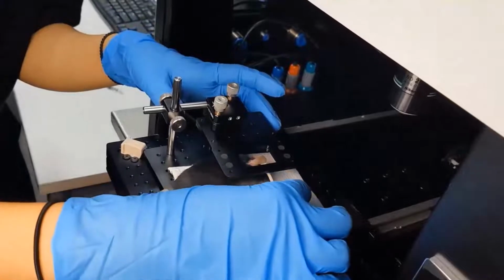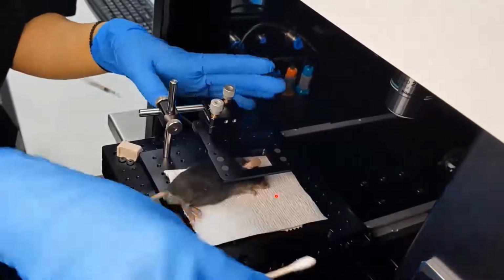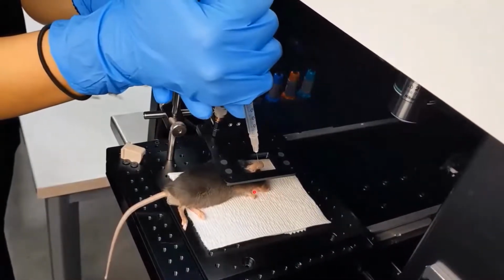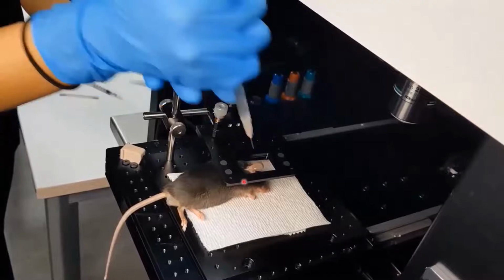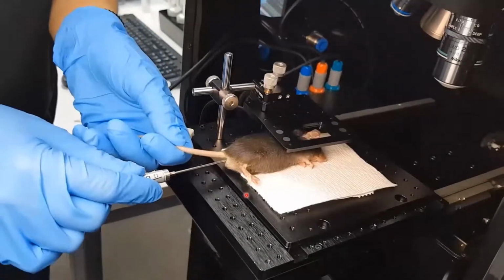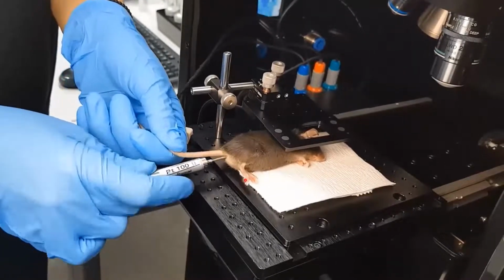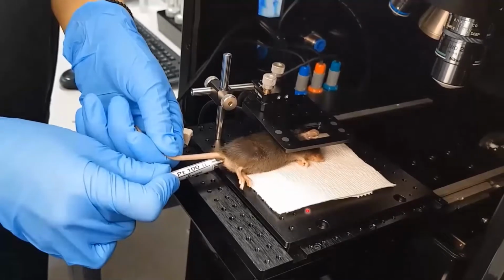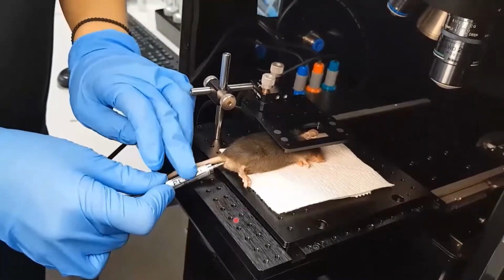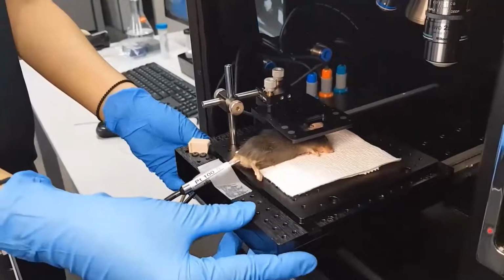After mounting, we drop distilled water on the cover slip for immersing the objective lens. And with the rectal probe for sensing the body core temperature, which has a feedback system with the stage heating plate, the mouse body core temperature is well maintained at 36 degrees during the whole imaging time.